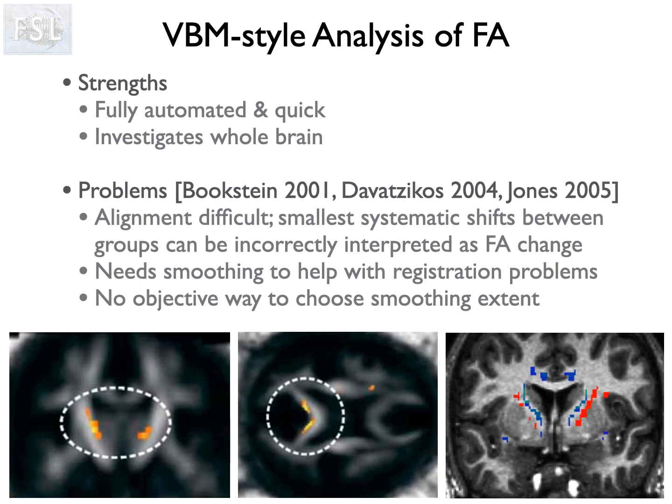While this approach works well for most MRI images, diffusion MRI images have the problem that there are very sharp boundaries at the edges between white matter and grey matter or CSF. If, after registration, there is some residual misalignment, which there always is, this might lead to false positives in the voxels close to the edge of the white matter, as illustrated here.